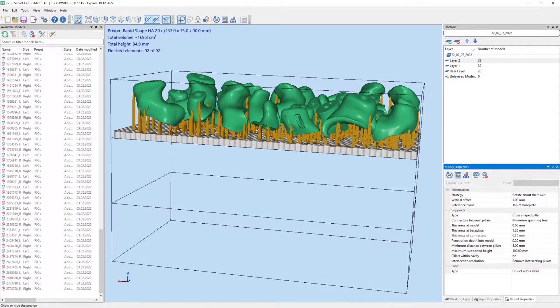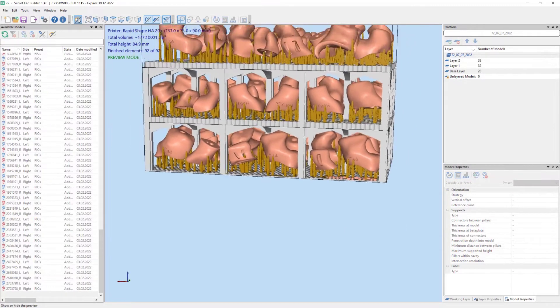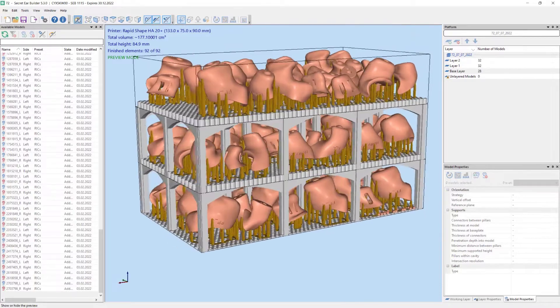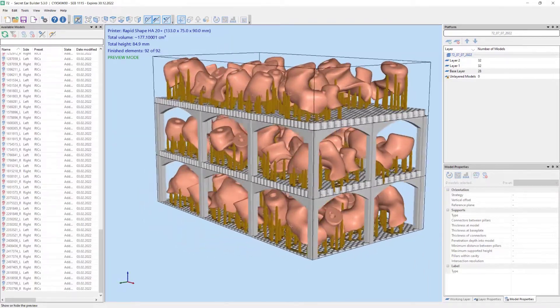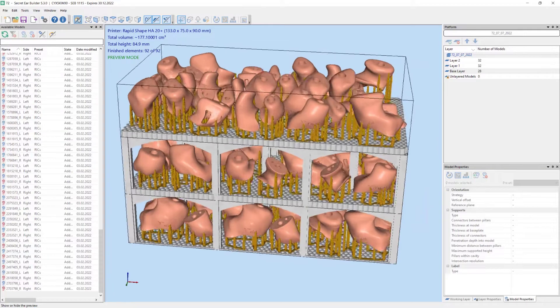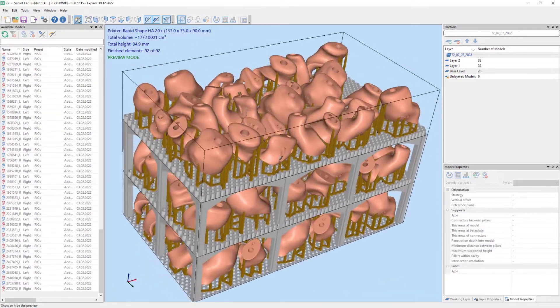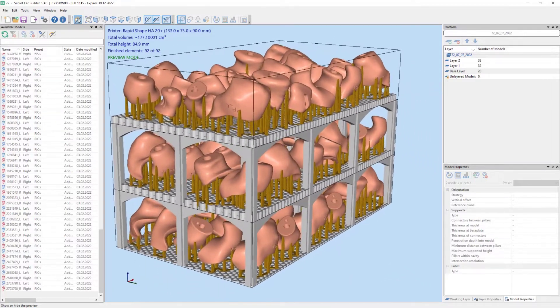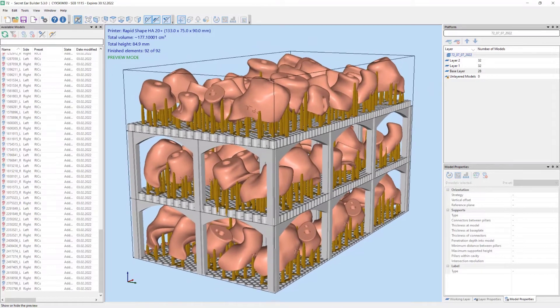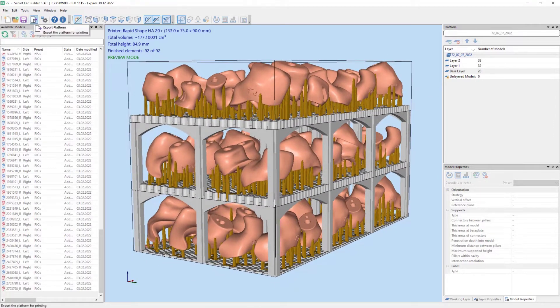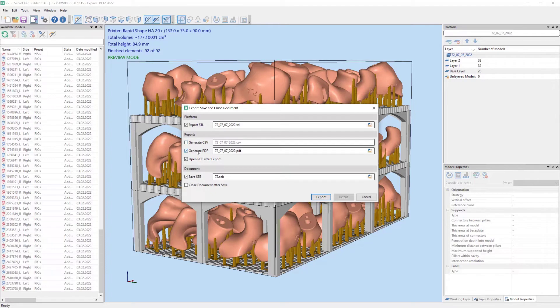We preview the entire print job. 92 ear pieces are ready for printing. With a click on the export button a dialog appears. It is possible to change export parameters here, but we accept the preset ones. A PDF report will be generated and will open automatically.